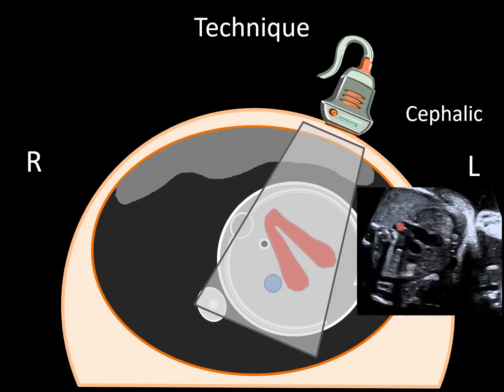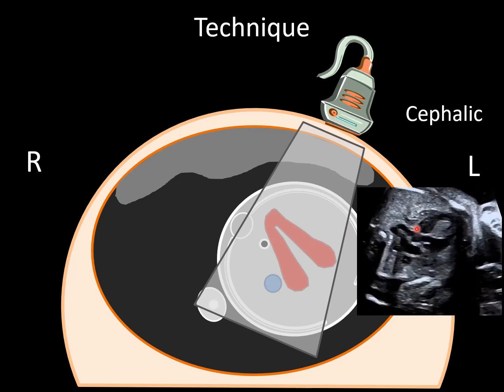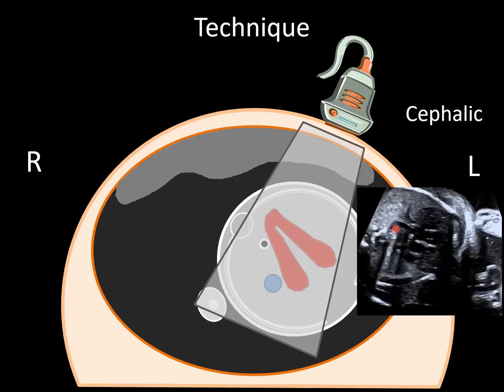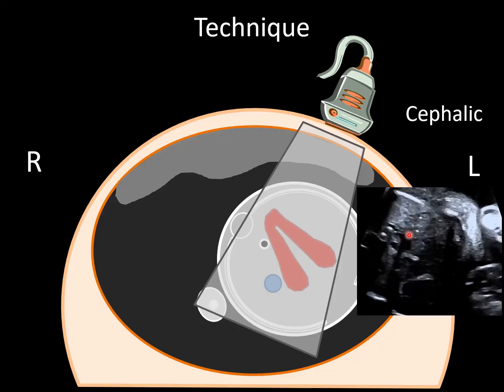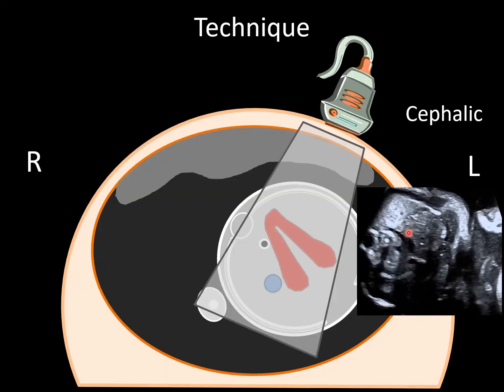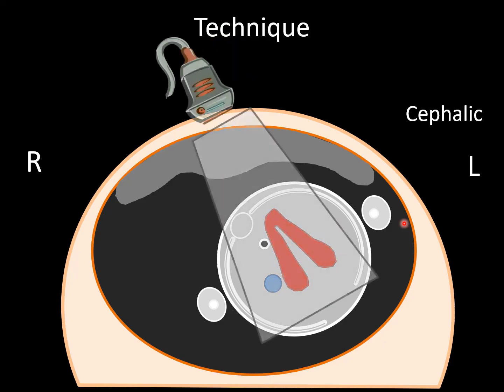And so this is what we're getting when we're scanning this way. And we see the V of the ductal and aortic arches here. In order to get a nice long axis view of the aortic and ductal arches, we're going to need to translate the transducer in a way that we align this V within the sector in a parallel format with the center of the sector.